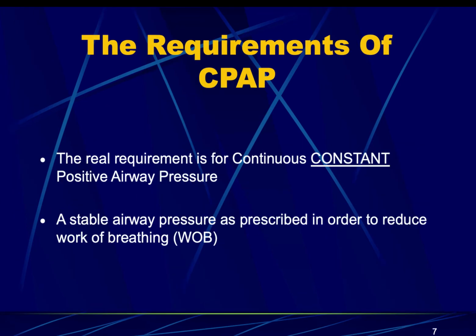CPAP. Guys, I'm going to go on my soapbox here for a second. I want you guys to understand that I love CPAP. Especially when I got out of paramedic school, when CPAP was first introduced to our system, we could only use it for certain disease processes. And there were a lot of medics out there that realized the good of CPAP and started breaking protocol, I guess, or breaking standard procedures, and giving this to patients that there were no protocols for.